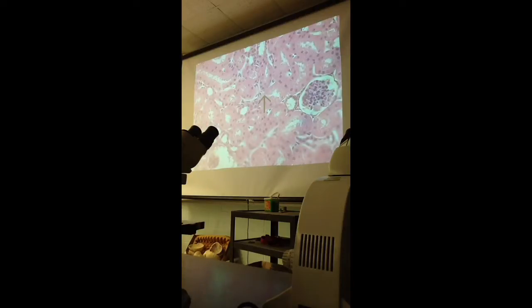Any questions on this slide? So you might get questions like, in the field of view, you are able to see the proximal convoluted tubule. But I don't think we'll be asking questions like tip of the pointer, because you just move it a little. Maybe in Dr. Vijay's class, if you take histology, she'll be asking whether the tip of the pointer is on proximal convoluted tubule, distal, or macula densa.